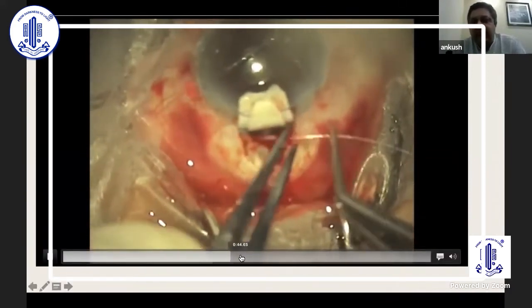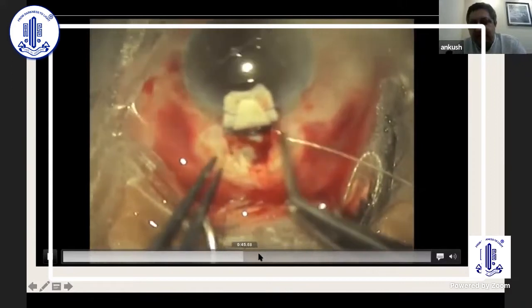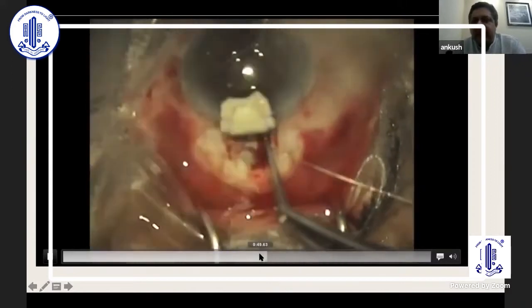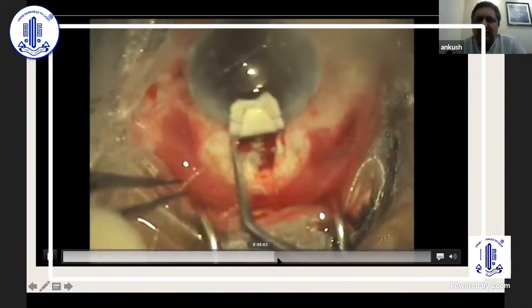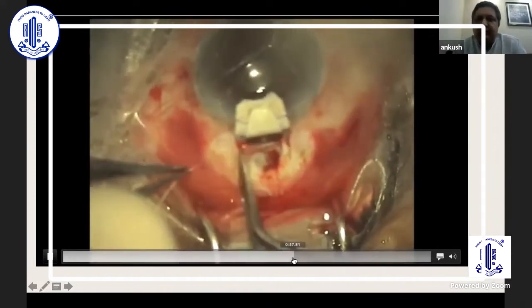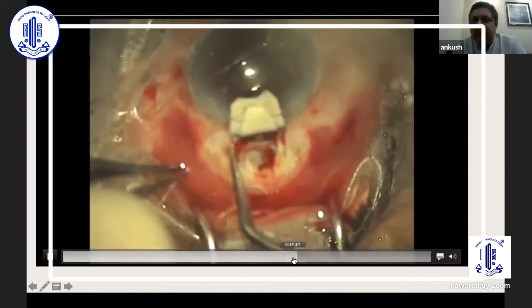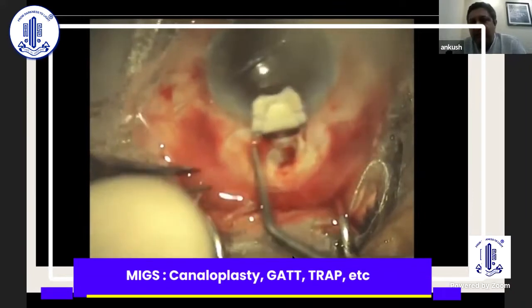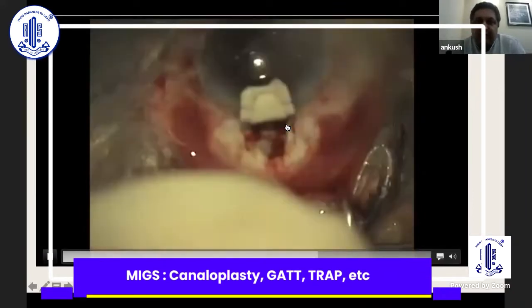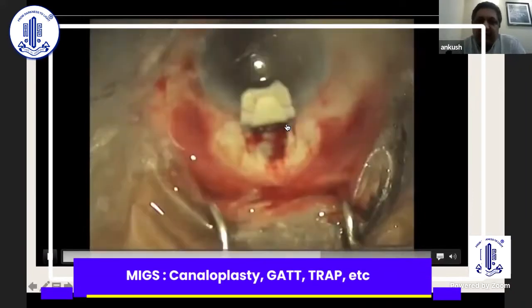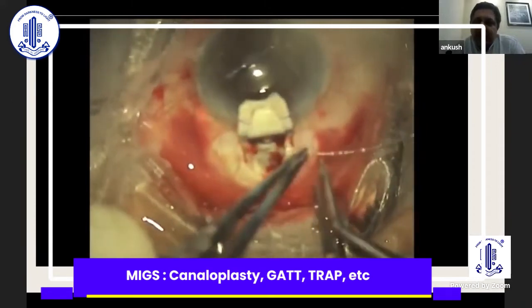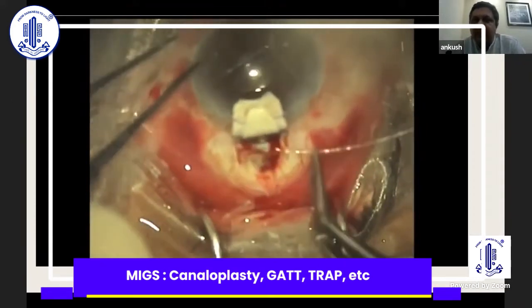I tried going in through one side and again through the other side — I tried my best to make it come out, but it was not coming through. Then I realized the problem: in these eyes, if the eyeball goes too soft, the Schlemm's canal collapses on itself, and once the canal collapses on itself, it develops kinks.